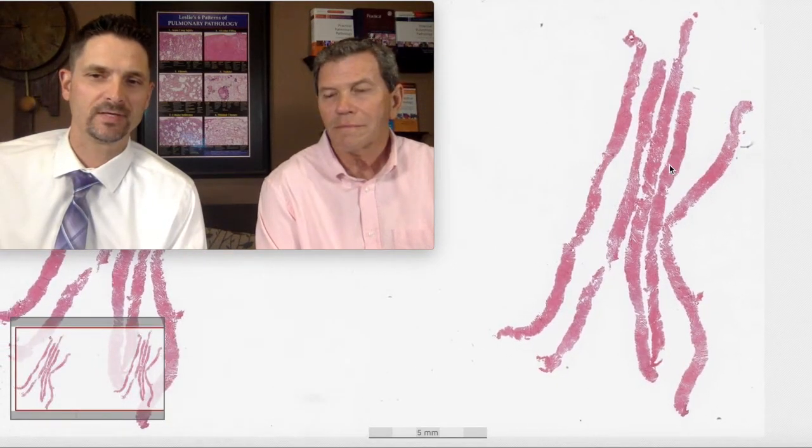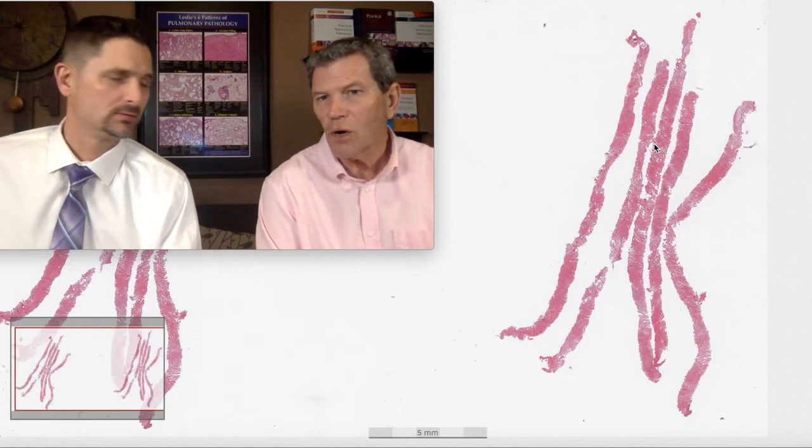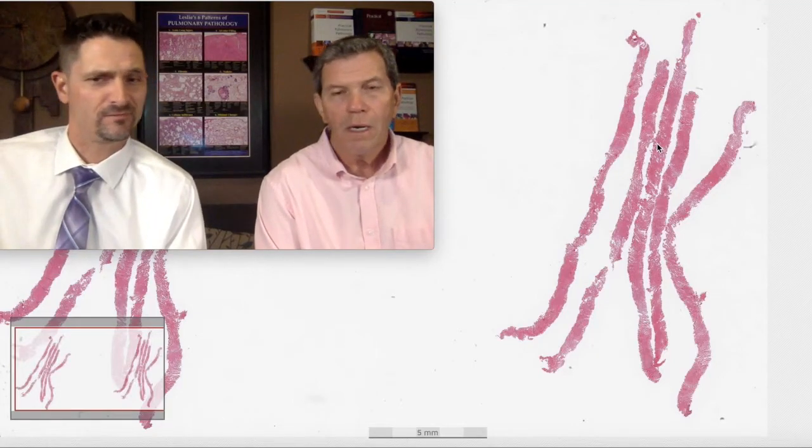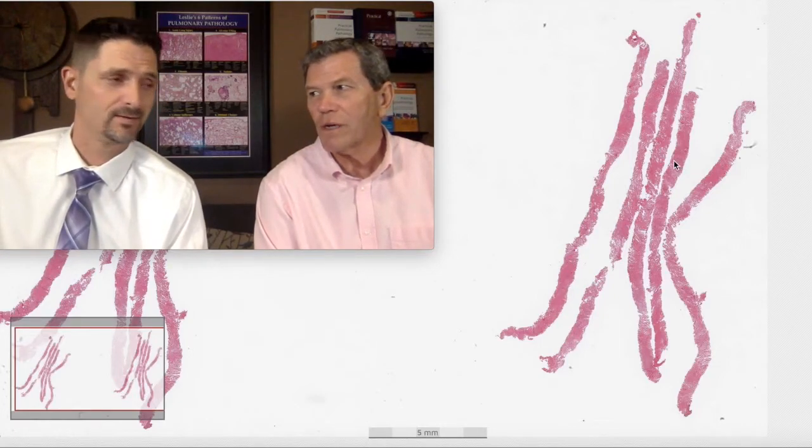And today we have a nice needle core biopsy for you, Kevin. Great. Not only one, but it looks like a whole set of them, huh? Yeah, five. And boy, are those generous. So this must have been a big target. What do you know about this patient?